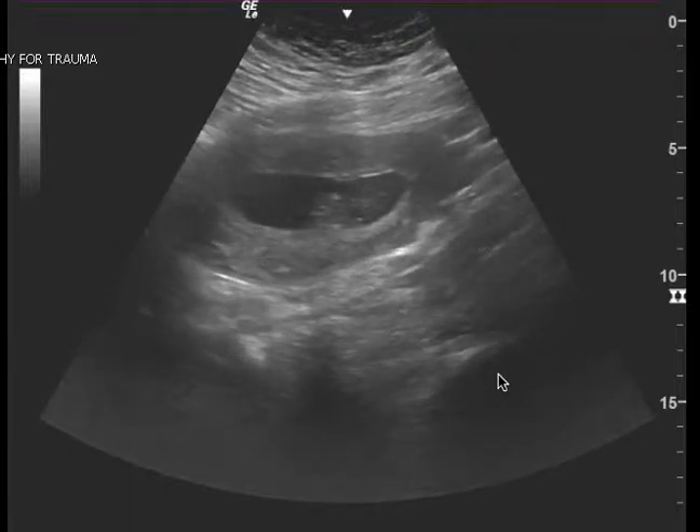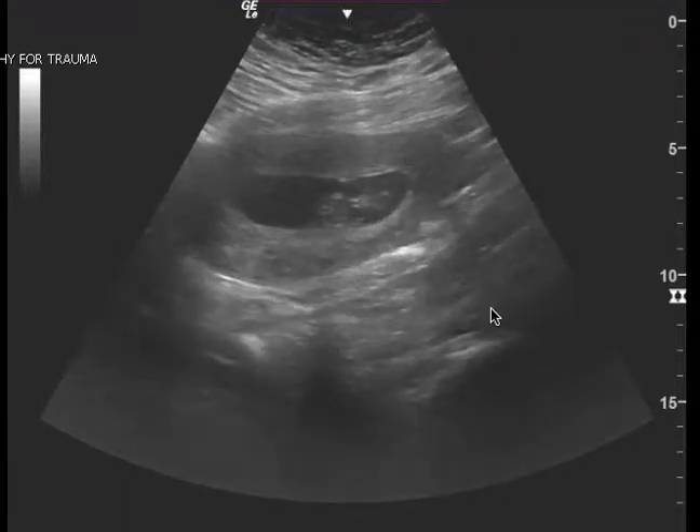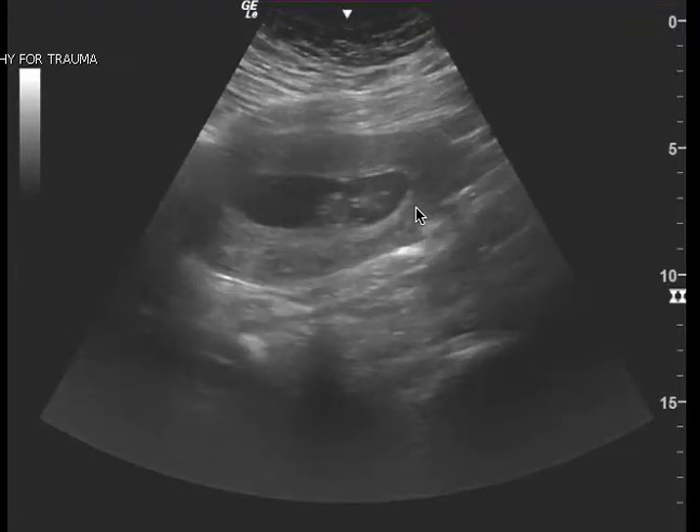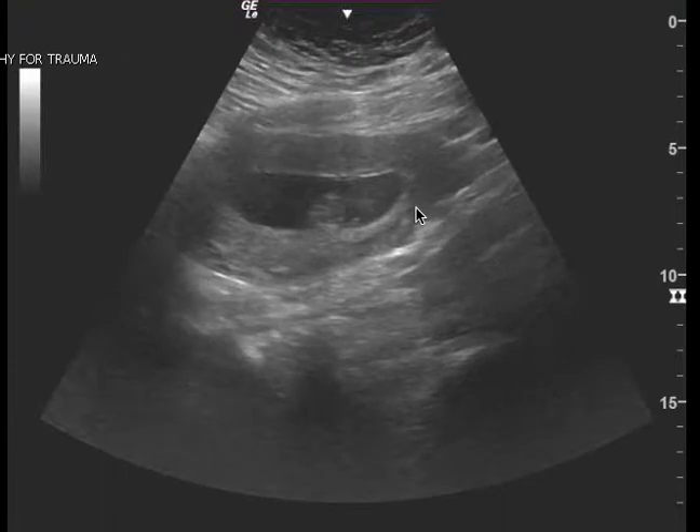This is an OB ultrasound, and based on the report, it was unclear to see if there was a heartbeat. I do agree, I don't see a clear heartbeat. I do see a little flicker, but it's hard for me to tell if that's a heartbeat or not.